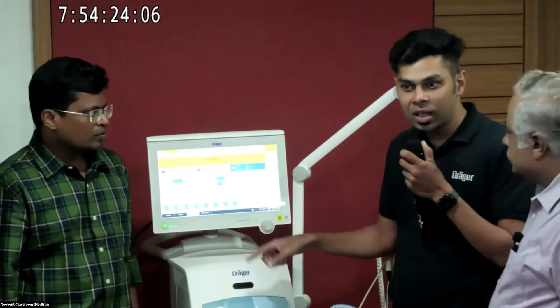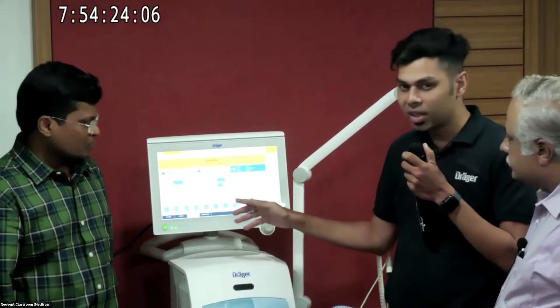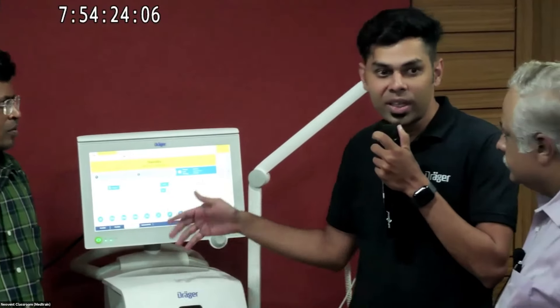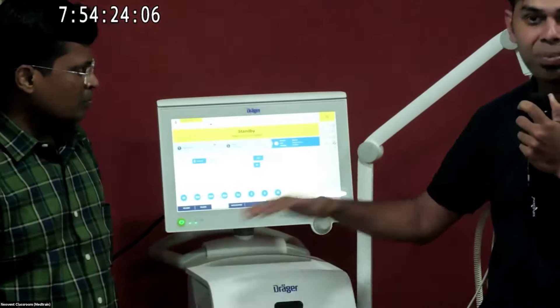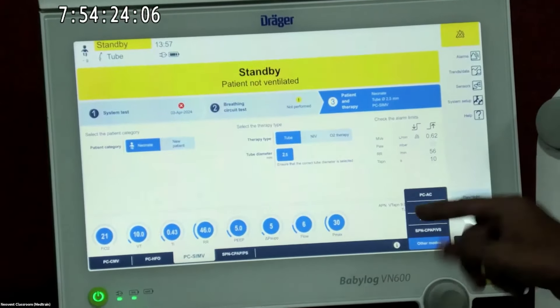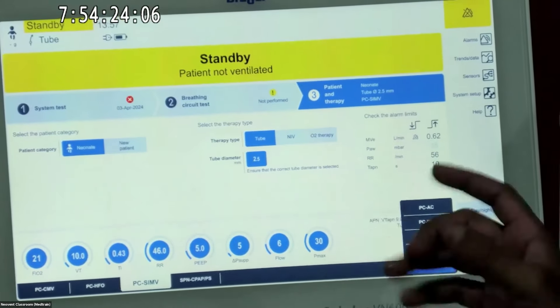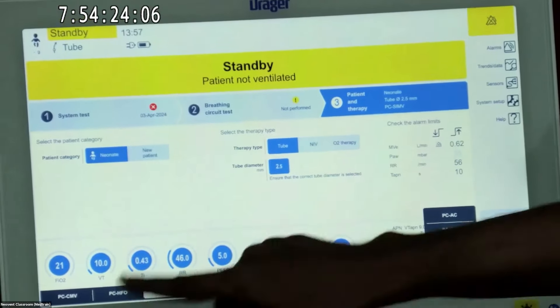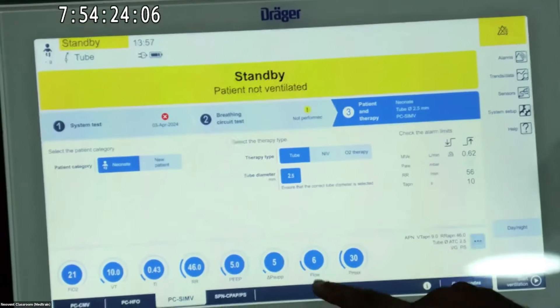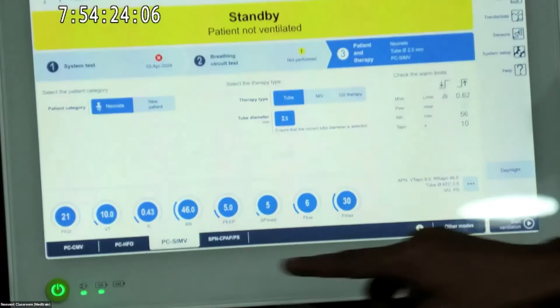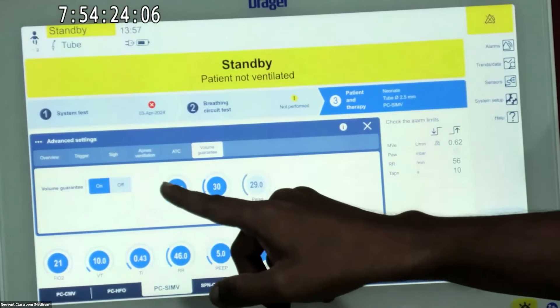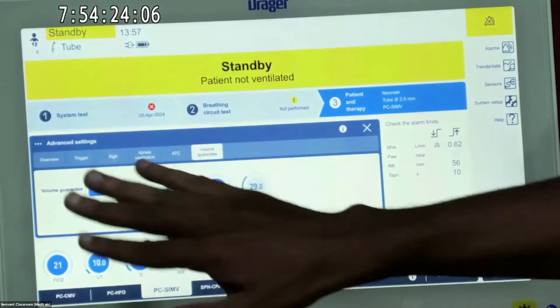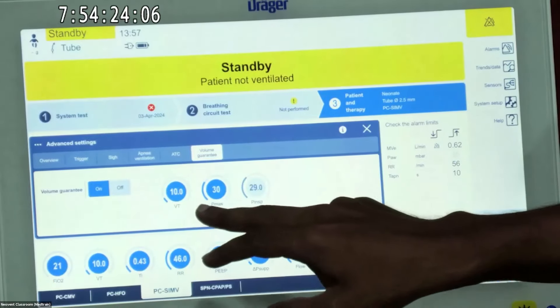We can add volume guarantee in all the pressure modes. This ventilator is a time-cycled, pressure-limited ventilator, so we can see only pressure modes here: PC-CMV, PC-SIMV, PC-AC, PC-PSV — no volume modes. In all modes of ventilation we can add volume guarantee. If I go to PC-SIMV, I press here and there is a volume guarantee setting — an additional setting. We go here and either switch it off or switch it on.